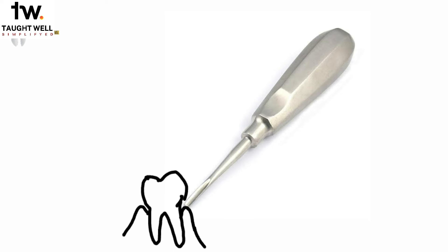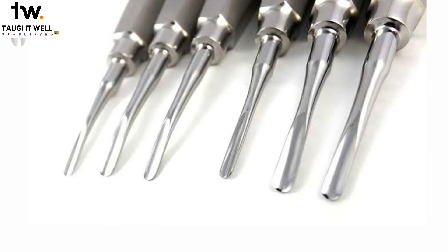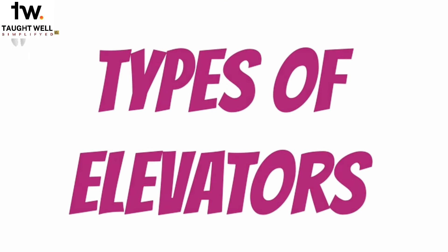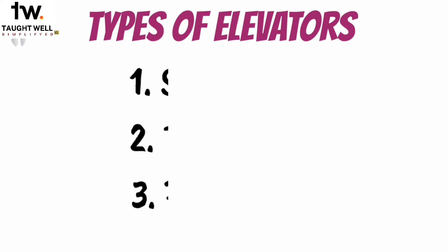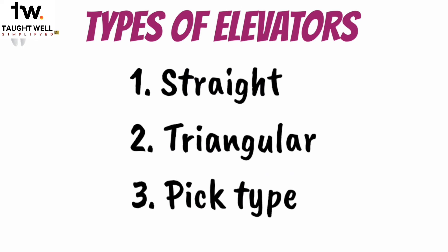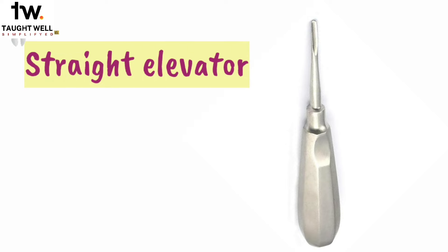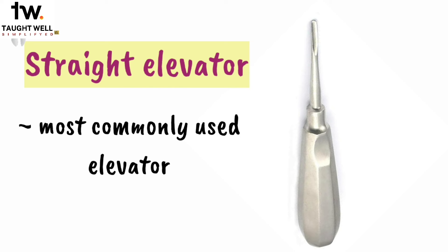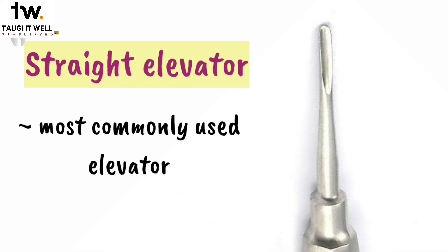The shape of the blade is different for different elevators. There are three basic types of elevators: straight, triangular, and pick type. This is the straight elevator. You can see the shape of the blade is straight. This is the most commonly used type of elevator. Now if you look closely, you can see that the blade is not just straight.